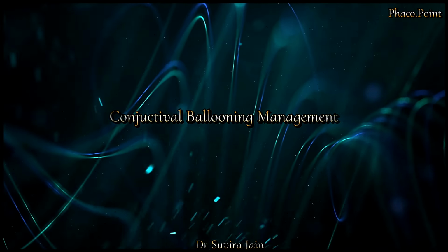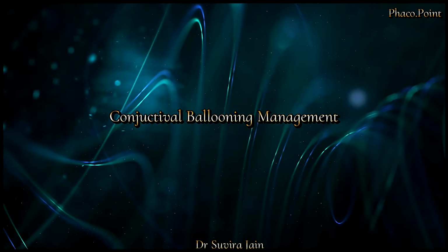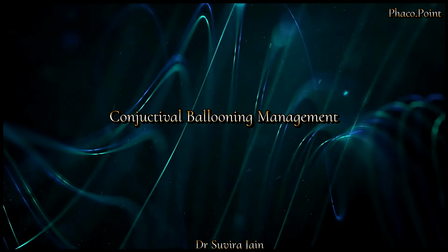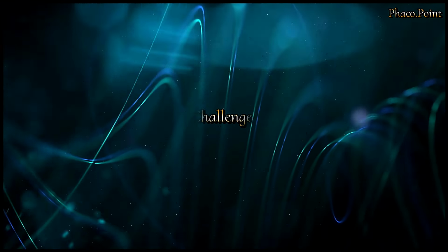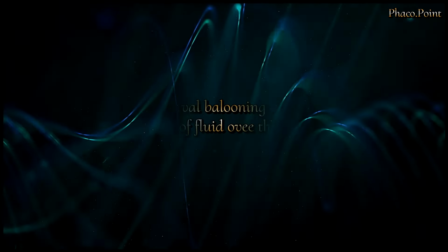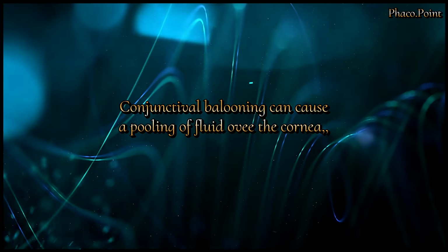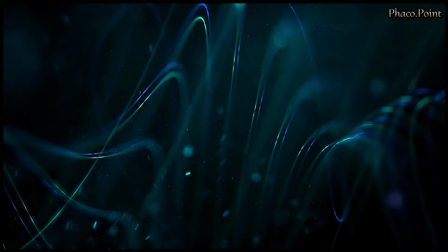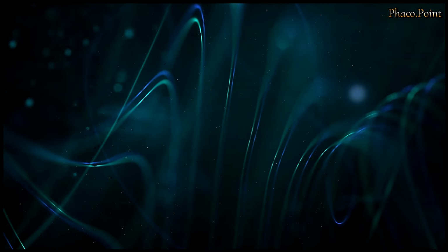Conjunctival ballooning during phacoemulsification is an intraoperative challenge which we sometimes face during phacoemulsification surgery. Now, the main challenge that we face when the conjunctiva is ballooned is the fact that it causes the fluid to pool over the cornea, resulting in annoying reflexes that can impair the intraoperative visibility. Thus, dealing with the conjunctival ballooning is an important step to managing it during surgery.